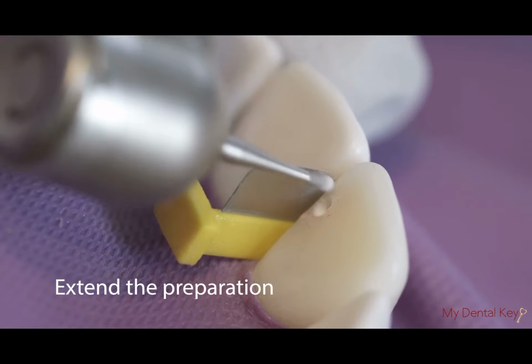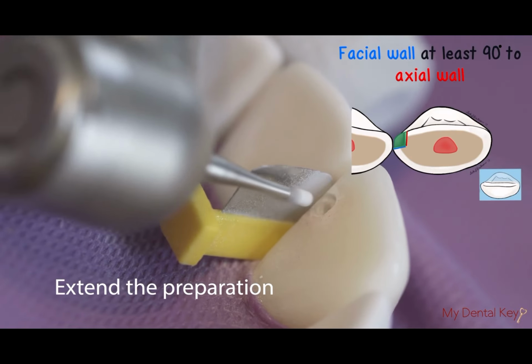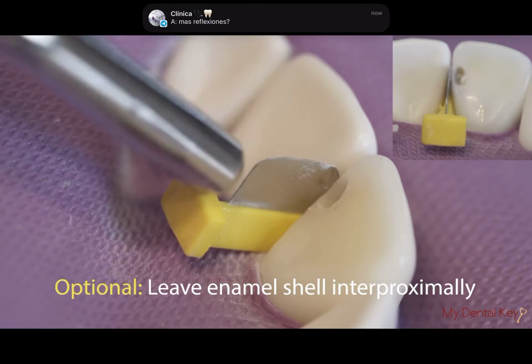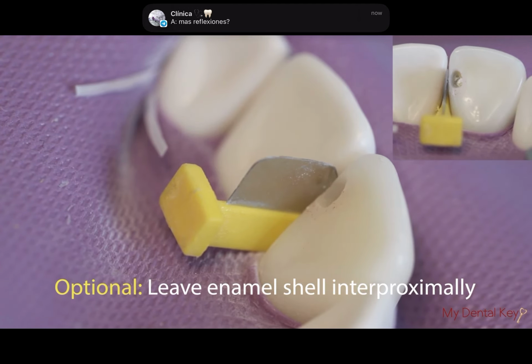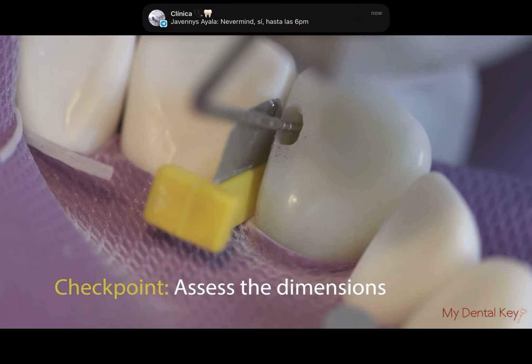Now extend the preparation on the lingual surface in the incisal gingival direction and mesial distal direction. Note that the facial wall should be at least 90 degrees relative to the axial wall. You may choose to leave a small enamel shell that will aid in protecting the adjacent tooth. Use the probe to check dimensions as you extend the preparation.